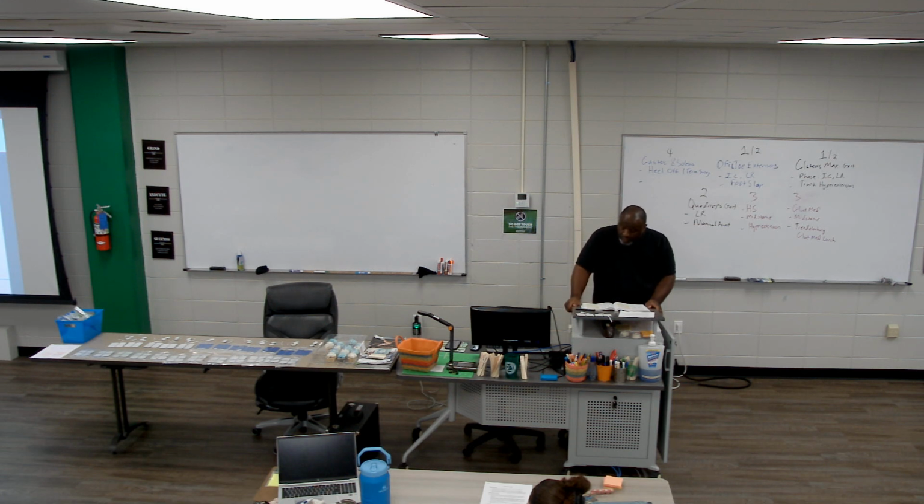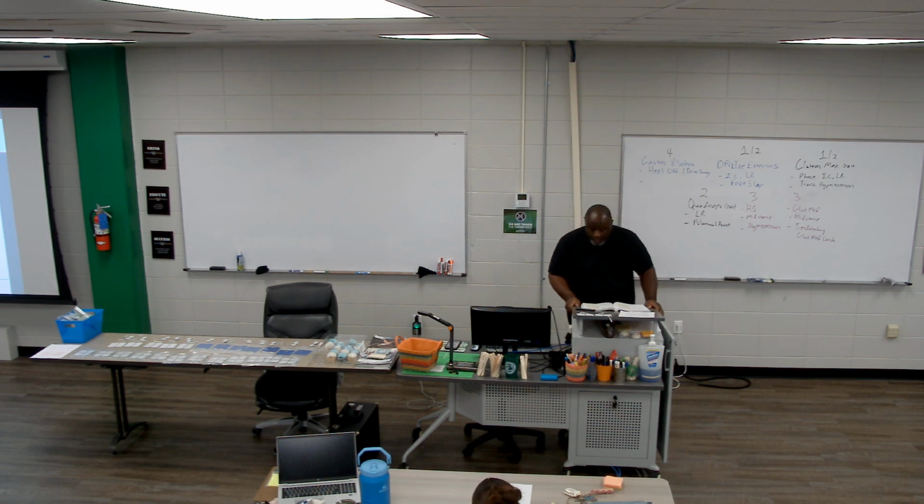The book says over on the right-hand side at the top, a frequency range of 1 to 120 pulses per second is sufficient for most therapeutic goals. Purposeful fused contractions occur between 15 and 50. We're going to give you some specific things.